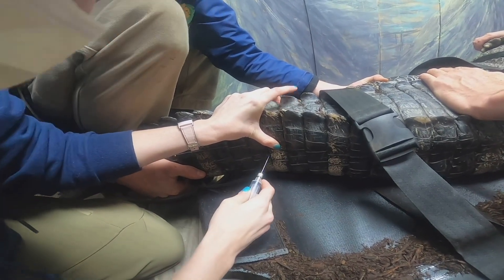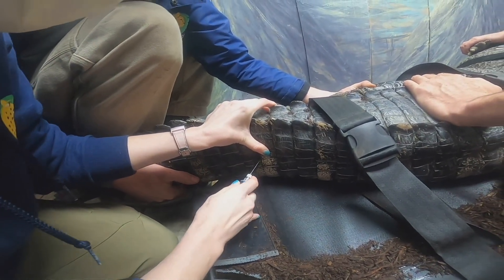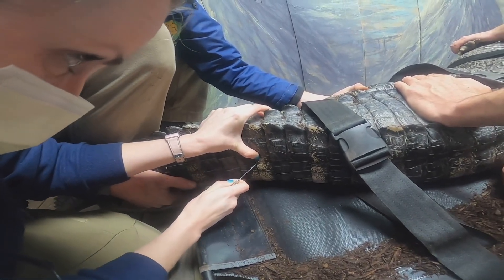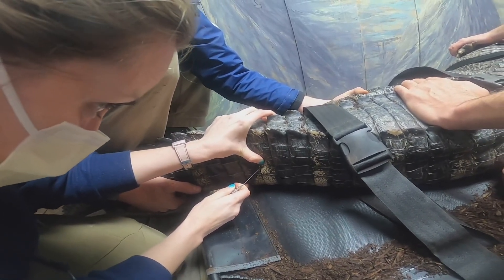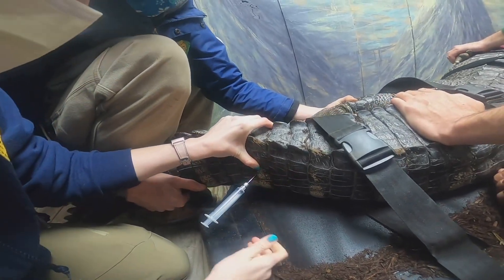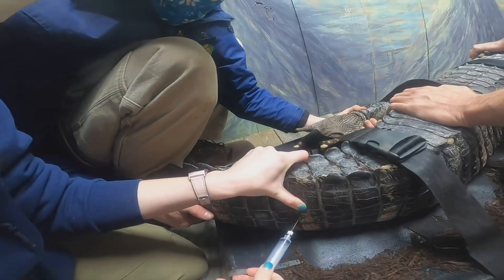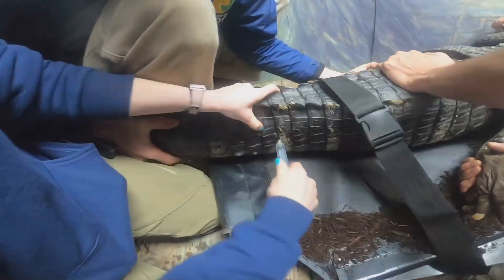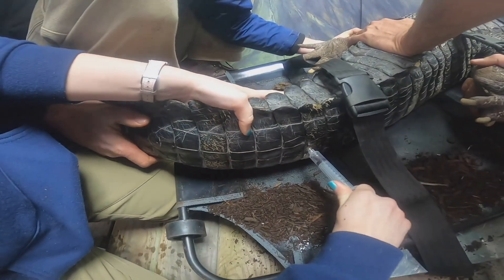...using a very long needle in order to sample blood from Penny, our over-a-hundred-pound American alligator. Once we have obtained a blood sample from our animals, you will see that we place it in specific tubes so that we can run specific tests on the blood.